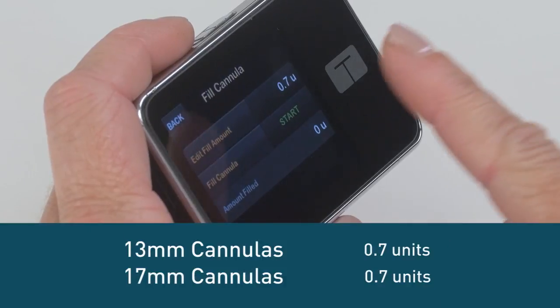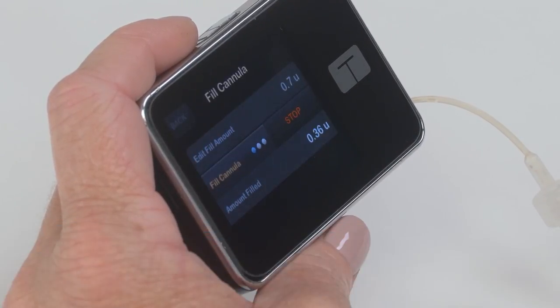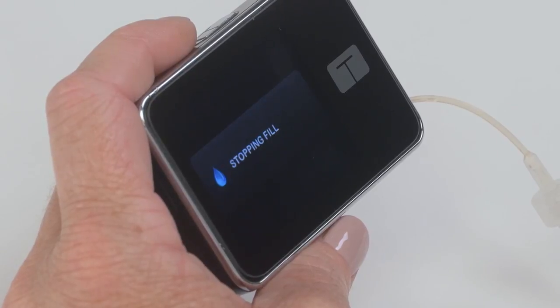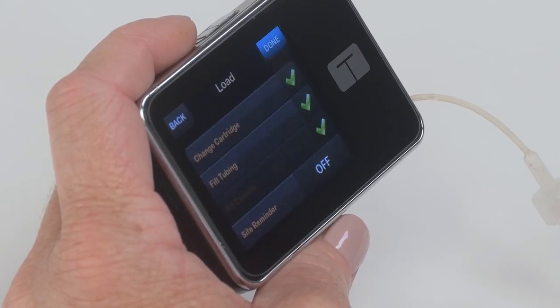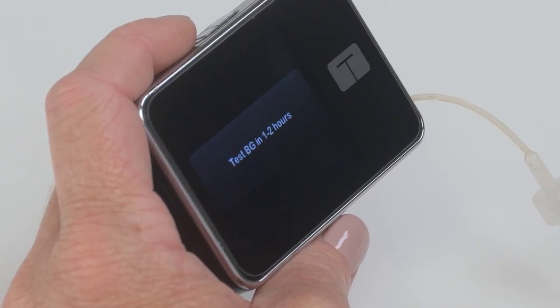Fill the cannula with 0.7 units. You are now ready to resume your pump and start delivering insulin. You've successfully completed the insertion. Always check your blood sugar two hours after inserting to make sure it's working properly.